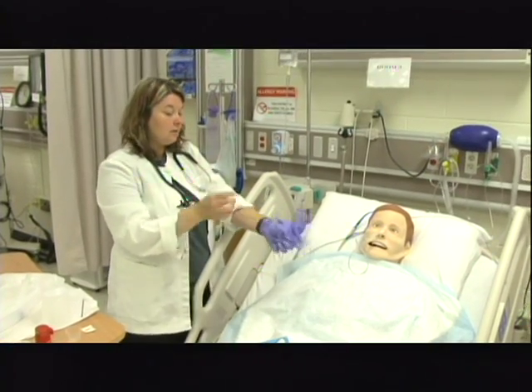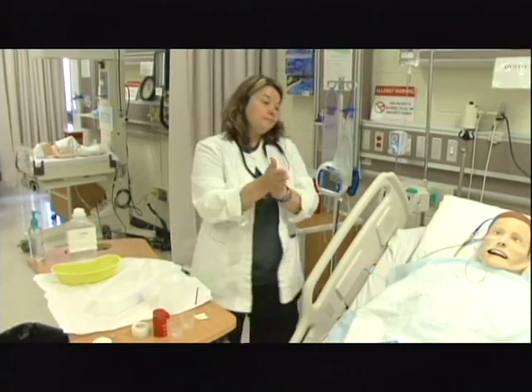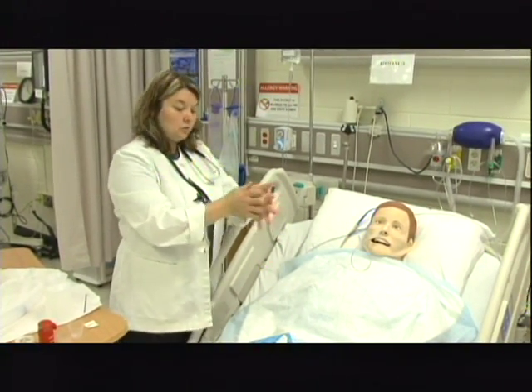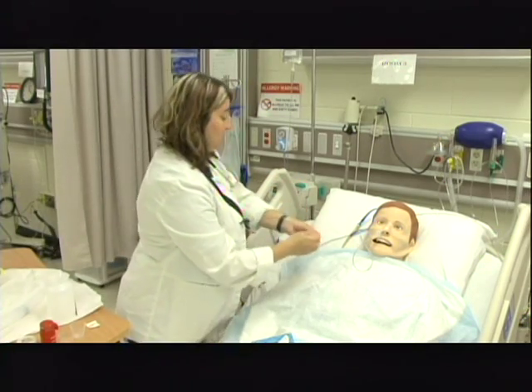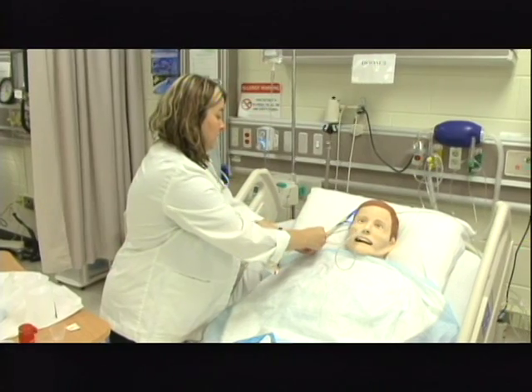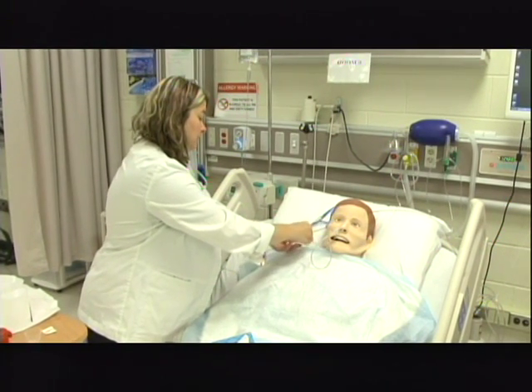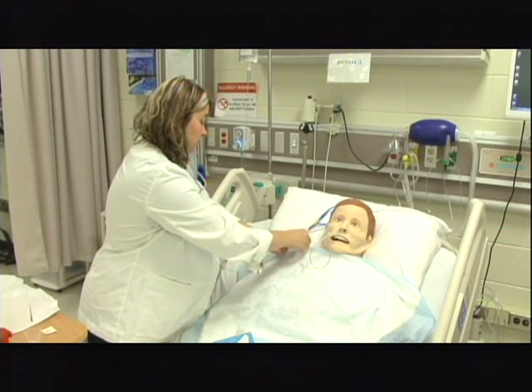I'm going to take off these gloves. I'm going to foam again. And I need to reconnect his tube to his gown. So I'm going to get the equipment that I had. I'm going to wrap this back around the tube. And as I'm doing this, I need to make sure I can get it back around here again.